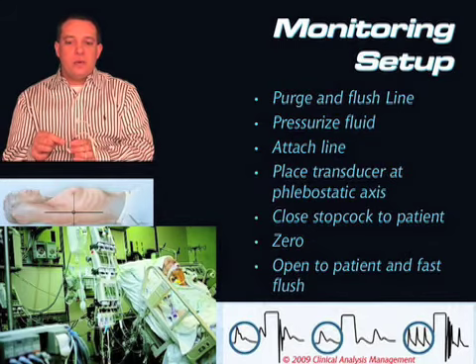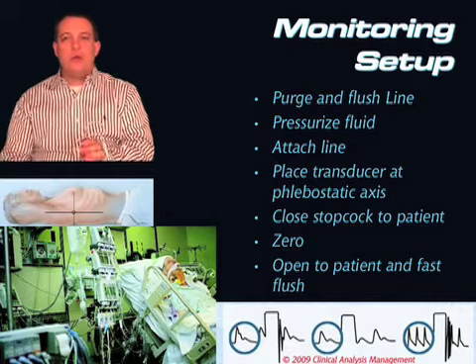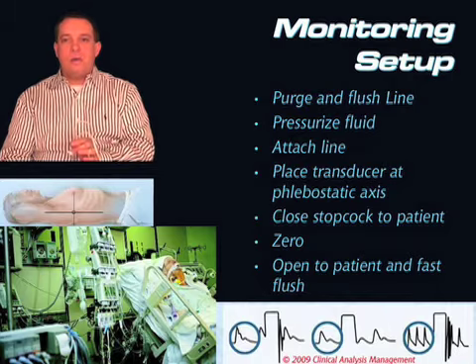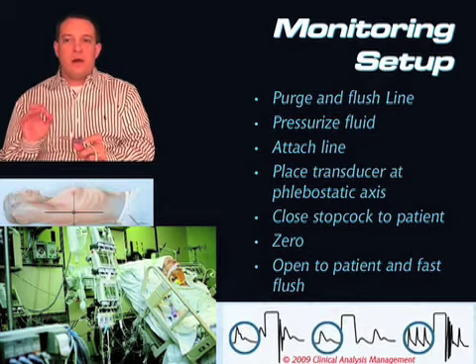We want to see that when we release this, there's a sharp downstroke, probably 2 or 3 little bounces, and then we go back into a waveform. That's perfect. That tells us the system is set up, that it's primed, that it's good to go, that this transducer has the ability to rapidly sense changes in pressure, and we are all set.